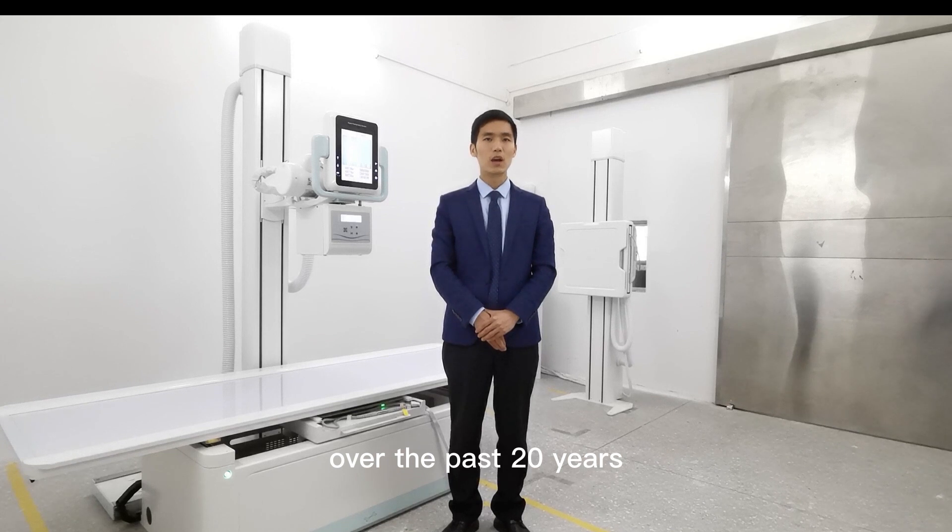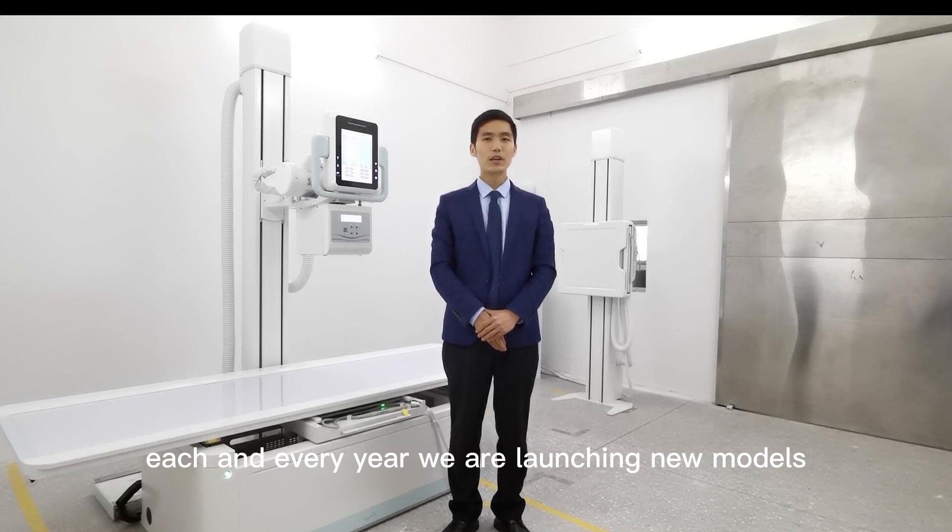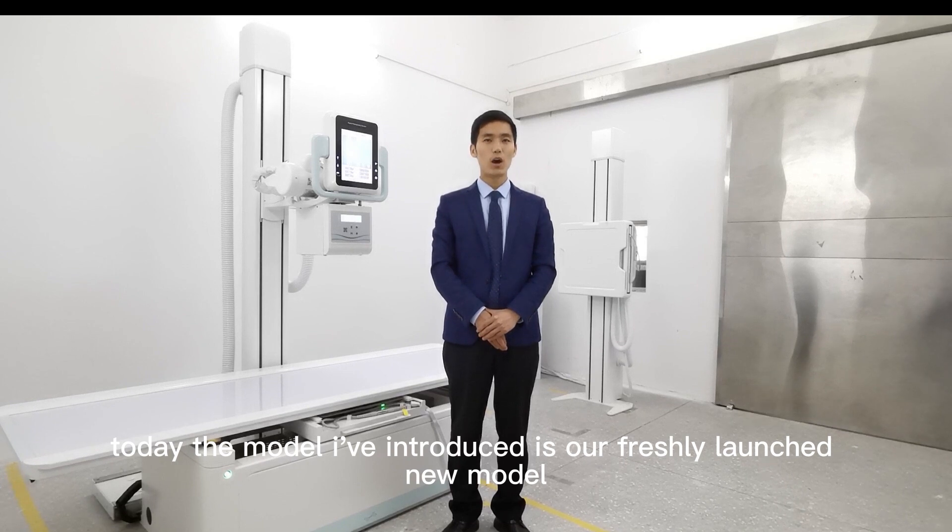Over the past 20 years, we have launched more than one million units across 10 decades of X-ray products, and every year we are launching new models. Today, the model I am introducing is our freshly launched new model.